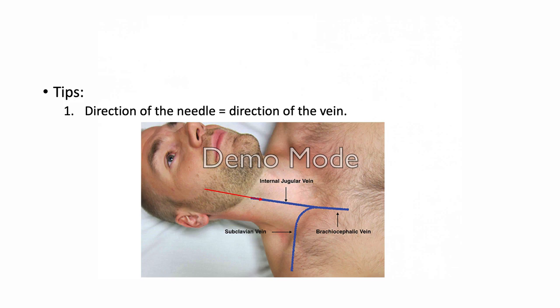I will give you a few tips about the insertion. The first one, the direction of the needle should be equal to the direction of the vein. And this must be a rule, even if we are using the ultrasound. Actually, with the ultrasound, it will be easier for you because you can direct your needle exactly with the direction of the vein if you use a longitudinal view.